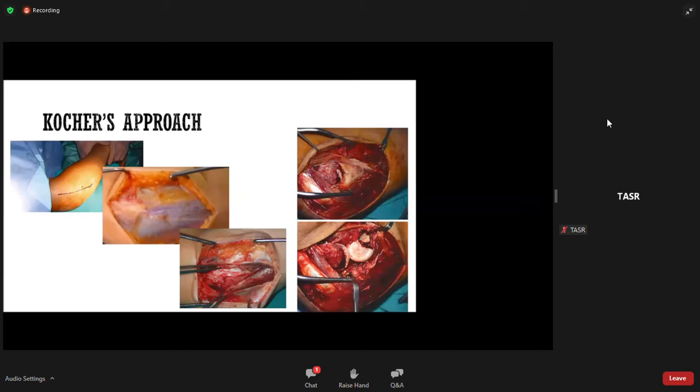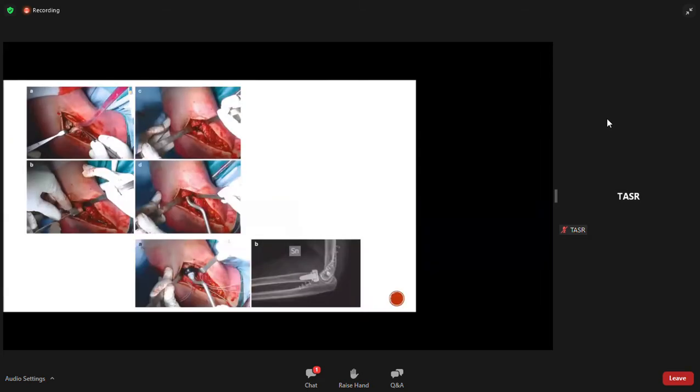I would say that with this interval, which can be extended more nicely with respect to the Kaplan interval, you can easily arrive on the capitellum and also repair the LCL, because the base of all radial head prostheses is to repair the LCL at the humerus side. If you don't repair the LCL, that prosthesis is going to have a very poor outcome with risk of being unstable.